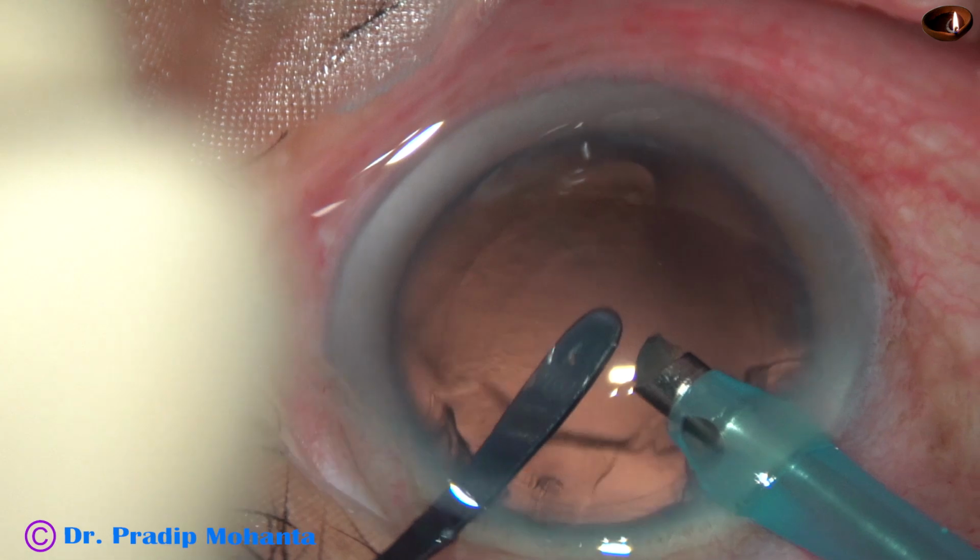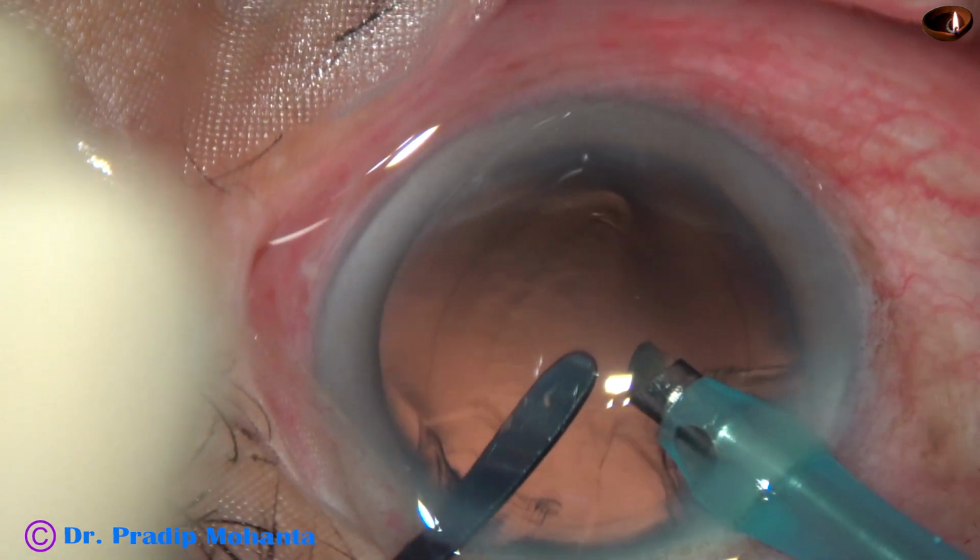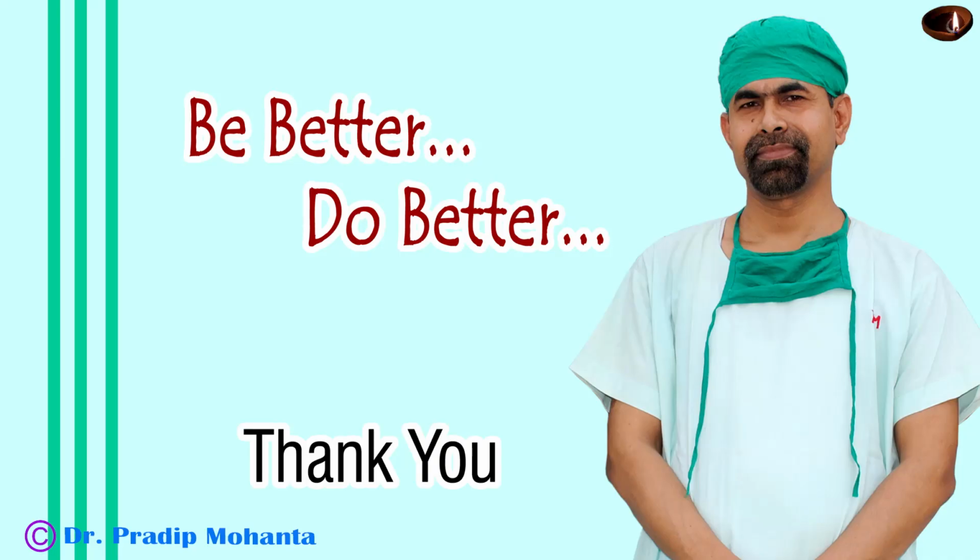That's it. In this video I wanted to show the lens tip knife that I used, the chopper, and this instrument, the posterior capsular protector. Thank you very much for your attention.